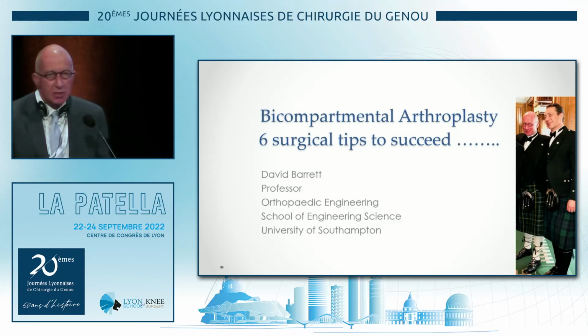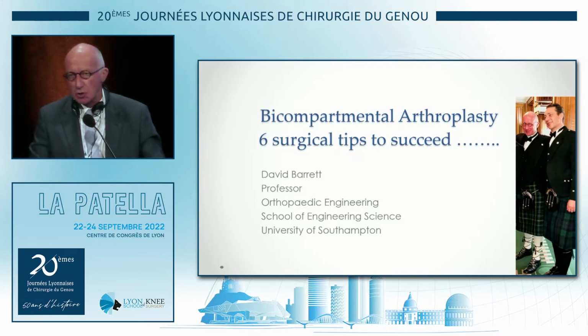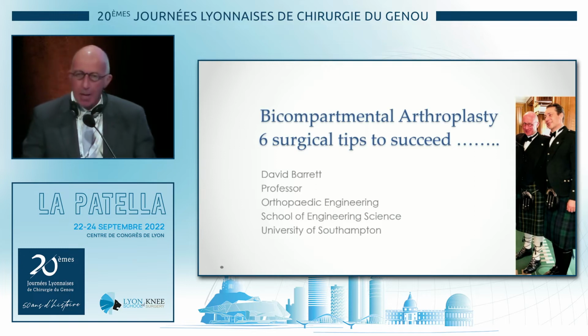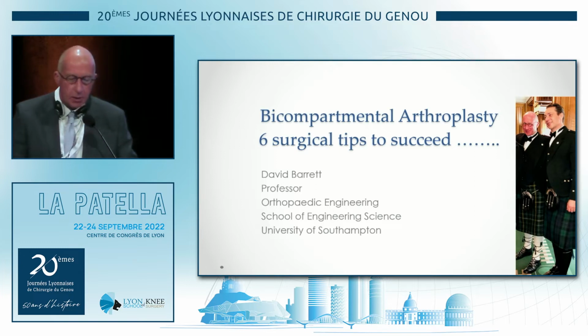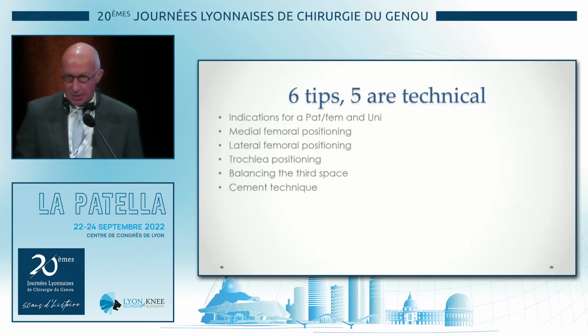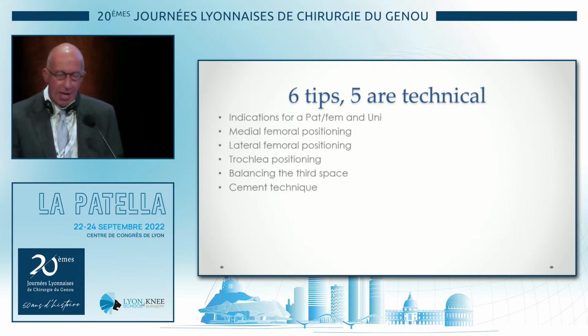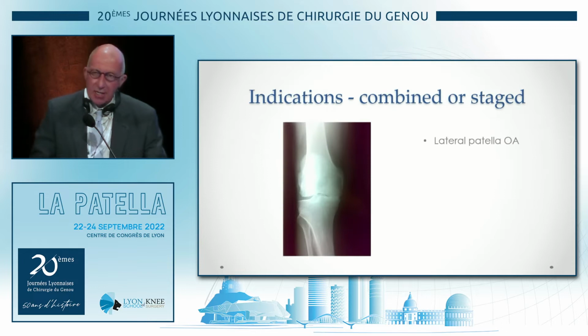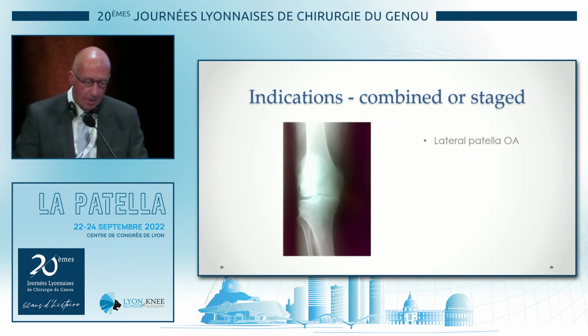Okay, so you can see that Sebastian and I wear the special costume for crazy people to put in 2 implants in one knee. Okay, but we think it's a good idea, and there are some very important tips, 5 of which are technical, which means you have to be a very able surgeon and you have to understand what to do. Let's look at the indications for bicompartmental, okay?